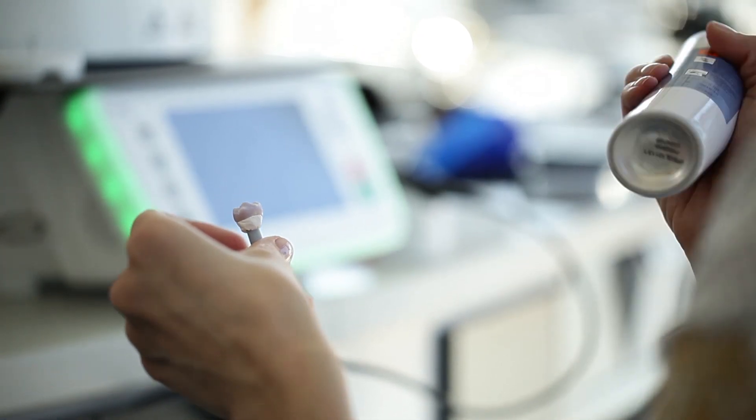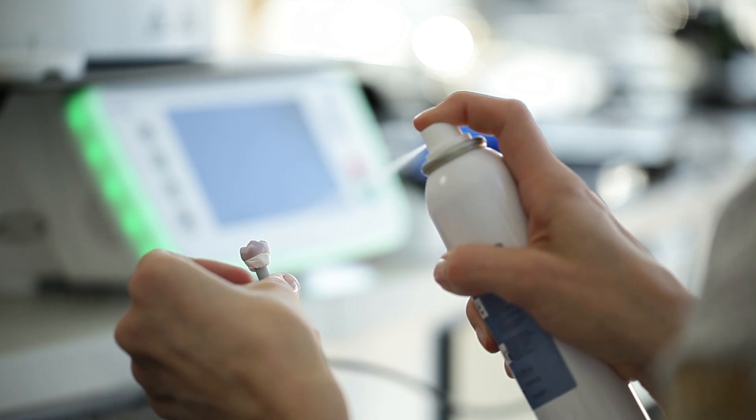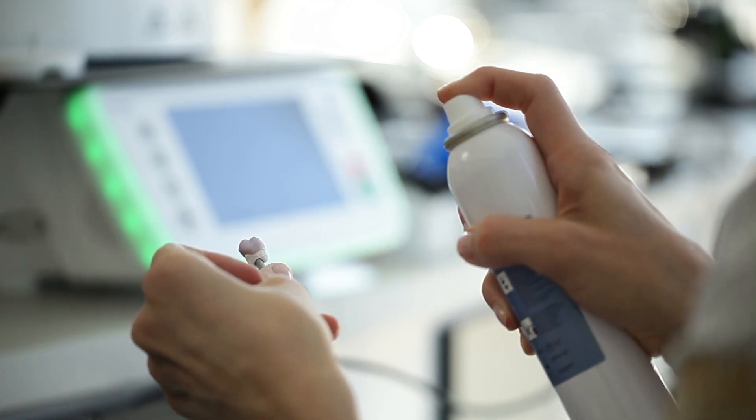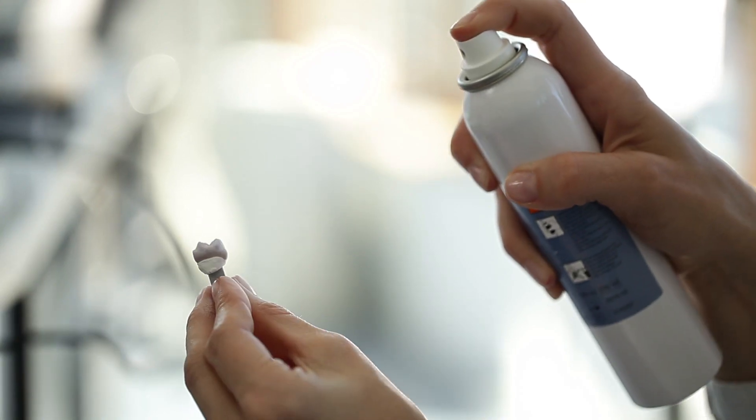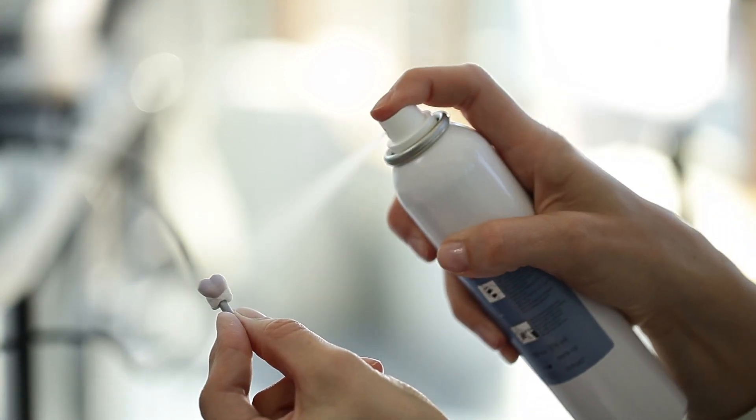Before you apply the IPS Emax glaze spray, vigorously shake the can until the mixing ball moves freely within the container. Spray the glaze at a distance of approximately 10 centimeters directly on the unfired stains.